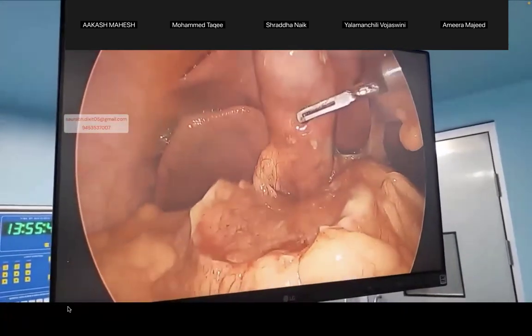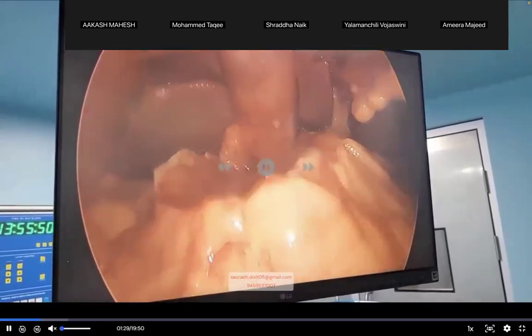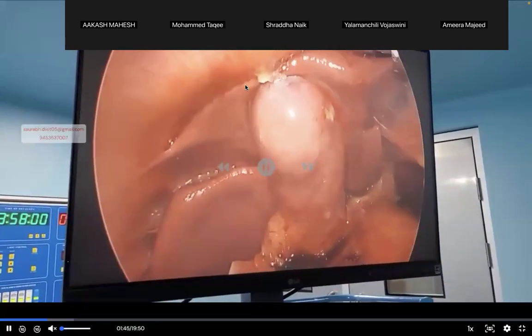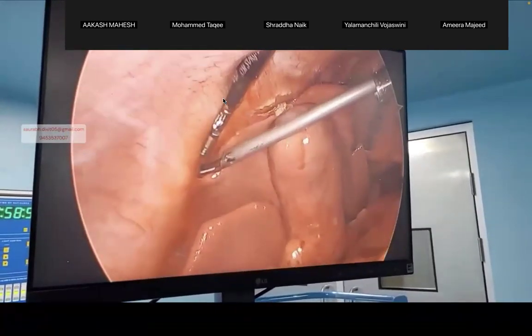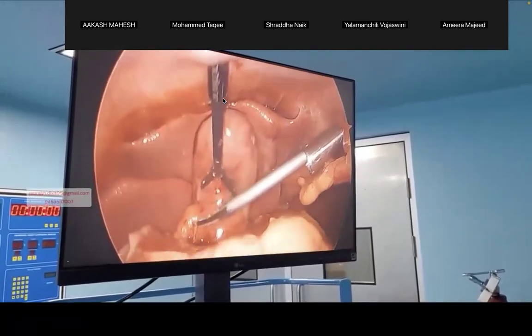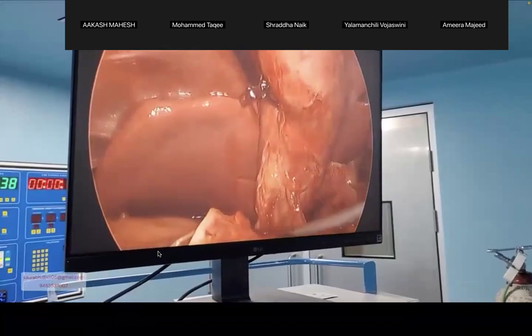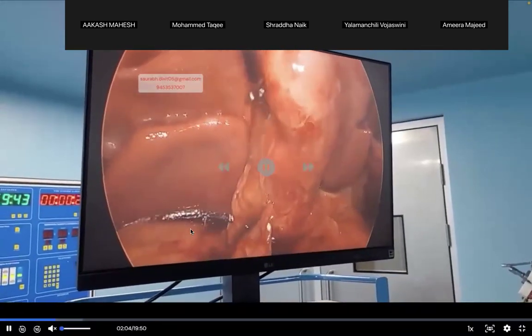The biliary anatomy is also altered. Just see, so much high. The Rouviere sulcus is still not visible in this case. So these are the cases where the chaos happens. Just see, the gallbladder is totally frozen and adherent to the anterior abdominal wall. There is no space with the liver also. Can you see? This shows that it is a case of empyema with Mirizzi syndrome, and a lot of chaos is there. So these cases are very challenging, and they can damage your reputation. Just see, there is so much pus coming out.